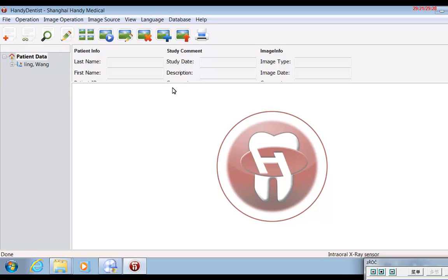So that is our brief introduction to the dental imaging software. Thank you very much for your time.